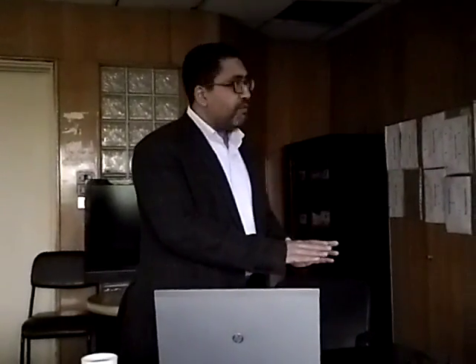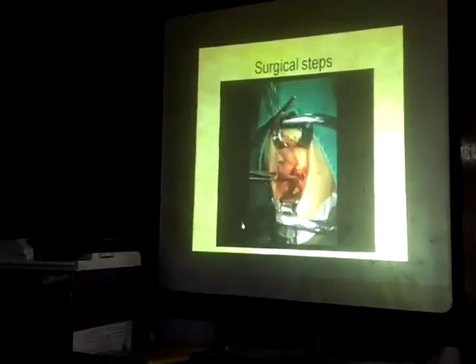You can never see the bed of the adenoid while you're standing there. Unless you have a 30 degree or a 70 degree endoscope, you can never see the bed of the adenoid. So the only way you can see it is that you can come to the side of the table and have a look directly into the operating bed. Okay, so this is the same way that I will be looking at the patient. You will see almost 90% of the adenoid bed. You can detect remnants, you can detect any bleeder, and then you are going to cauterize it by bipolar diathermy under vision. Okay.